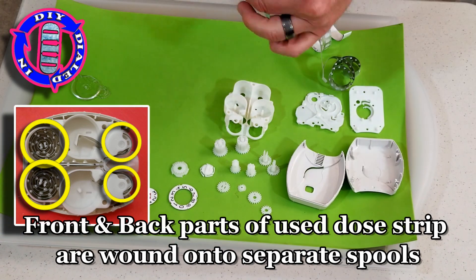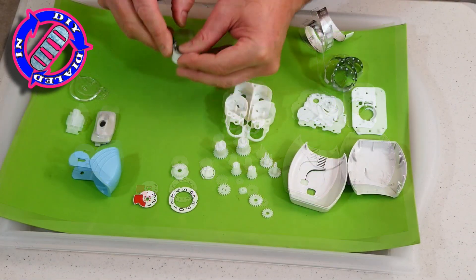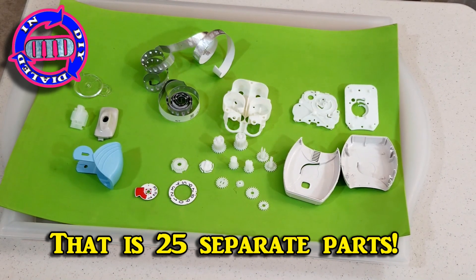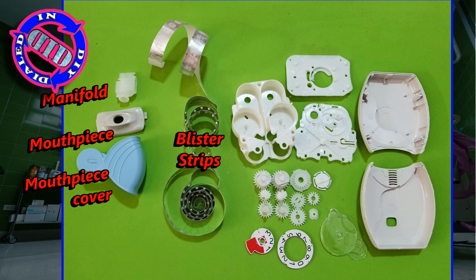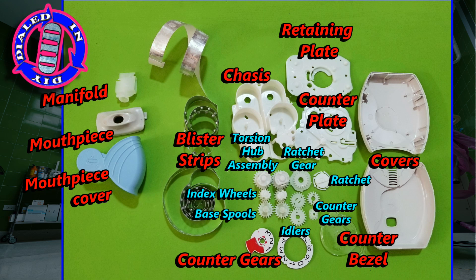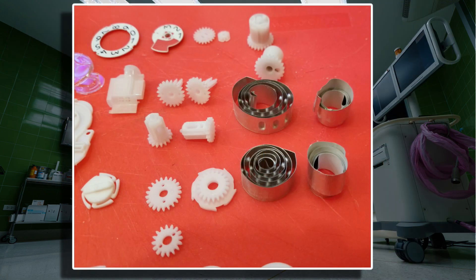And there you have it — all of the parts from inside a clever little piece of medical technology that has improved drug delivery for a lot of people with respiratory problems. Because I like to dial things in, I'm still looking for ways I might be able to reuse some of these parts. I'm thinking about using both sides of the shell, the mouthpiece at the top, and the blue cover cap to make either some form of a rechargeable LED flashlight or a secret stash device. What are your thoughts? Let me know in the comments below if you have some fun ideas for any or all of these parts.